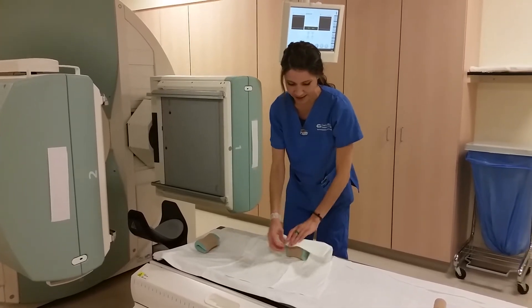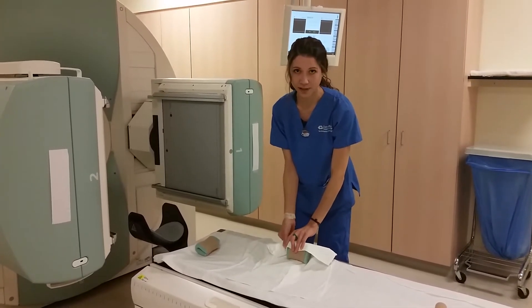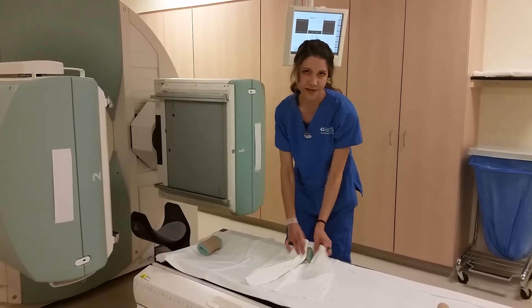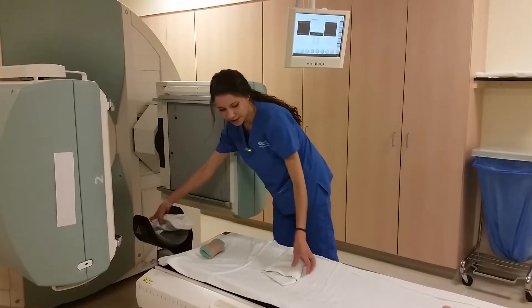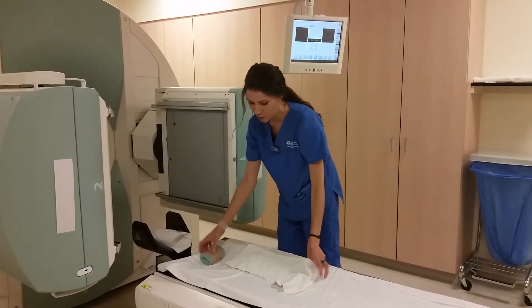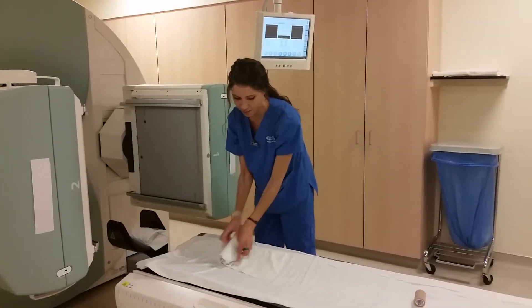The patient was injected two to five hours earlier. For this purpose, we'll say three hours, and then we'll return and she's here right now, so in just a moment I will go get her from the waiting room.